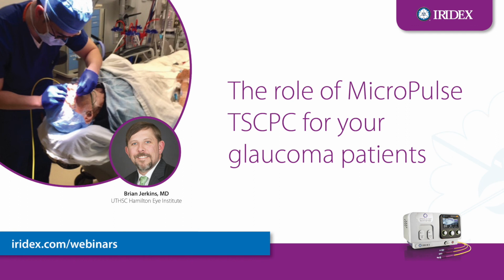Careful meaning when we're looking at the physics of it, there is that little bit of an exposed edge of the laser itself, right at the tip of the probe, that you want to be careful. If you push down and pull it the wrong direction, you can get a little conj tear, and over thin tissue, I'd want to be careful. But if it's vascular, I will still treat over that area very lightly.